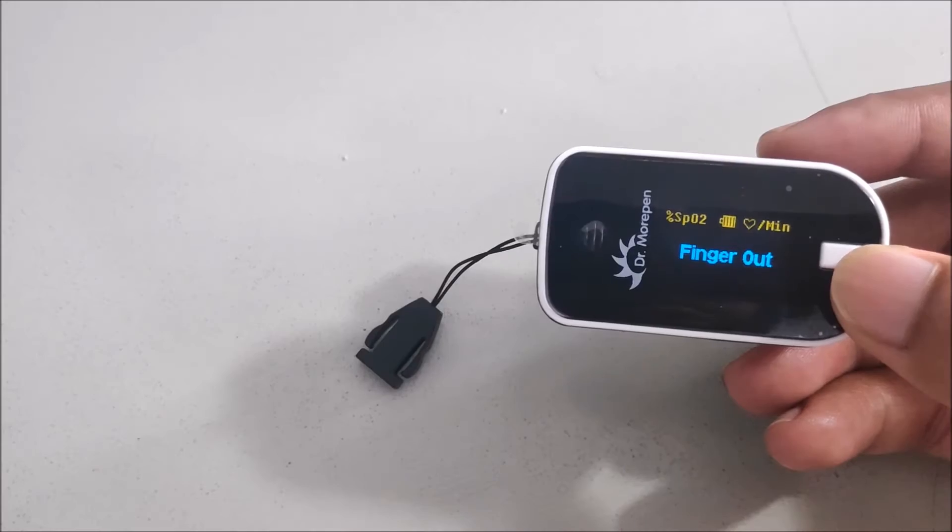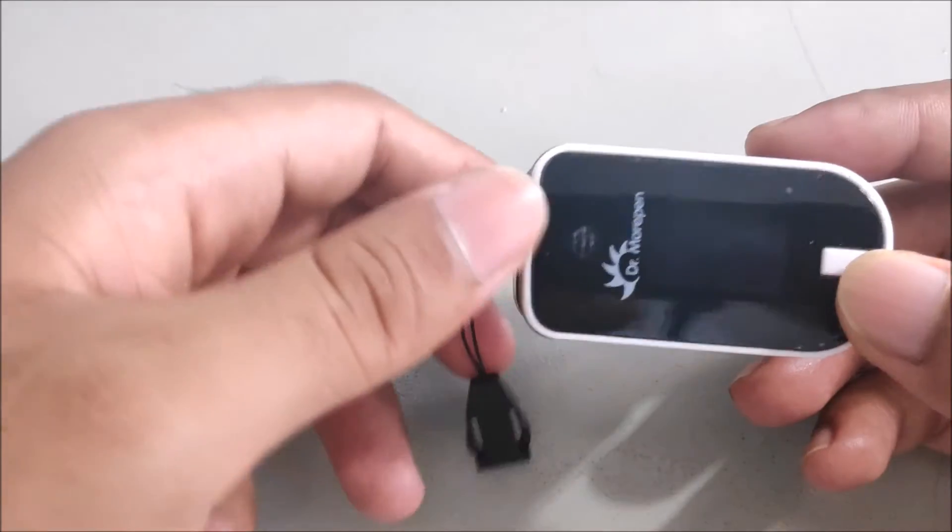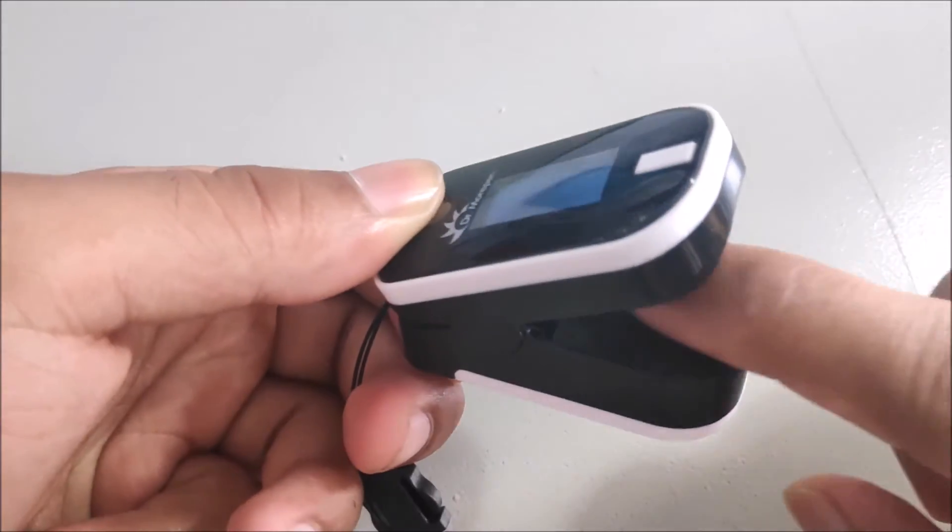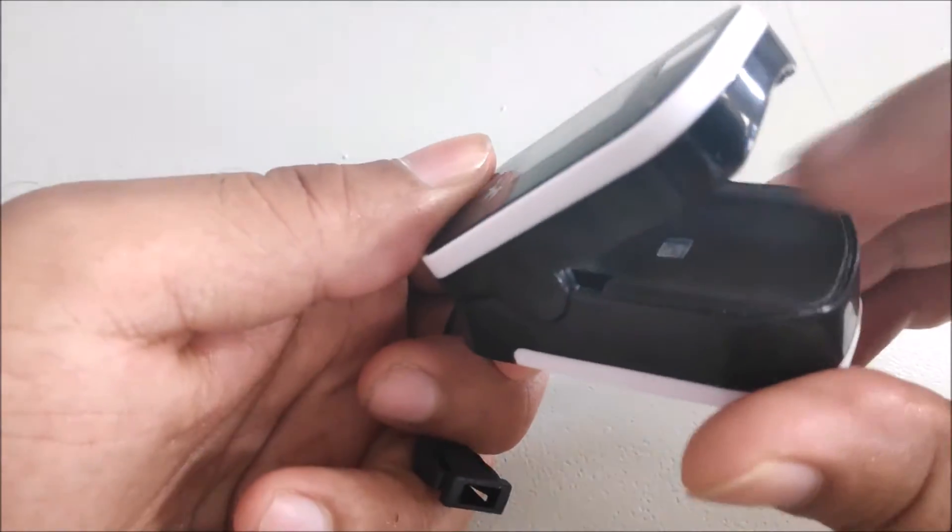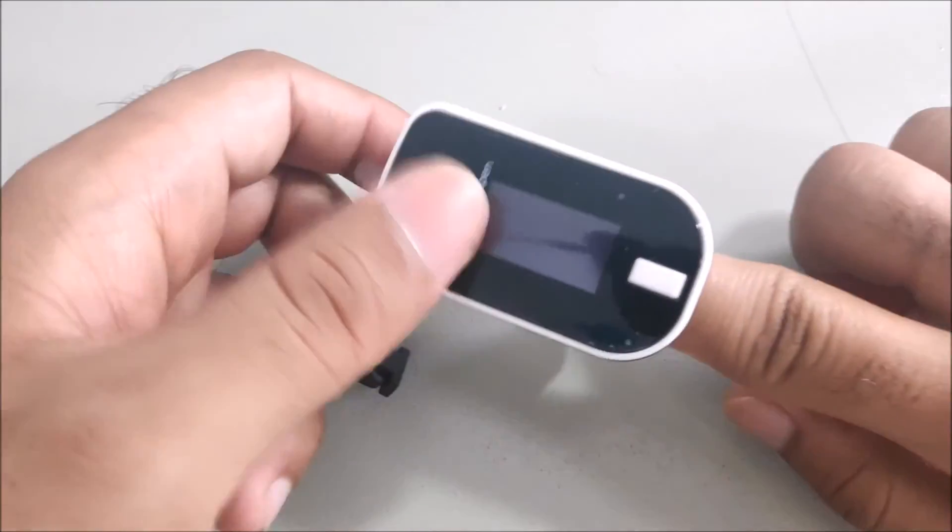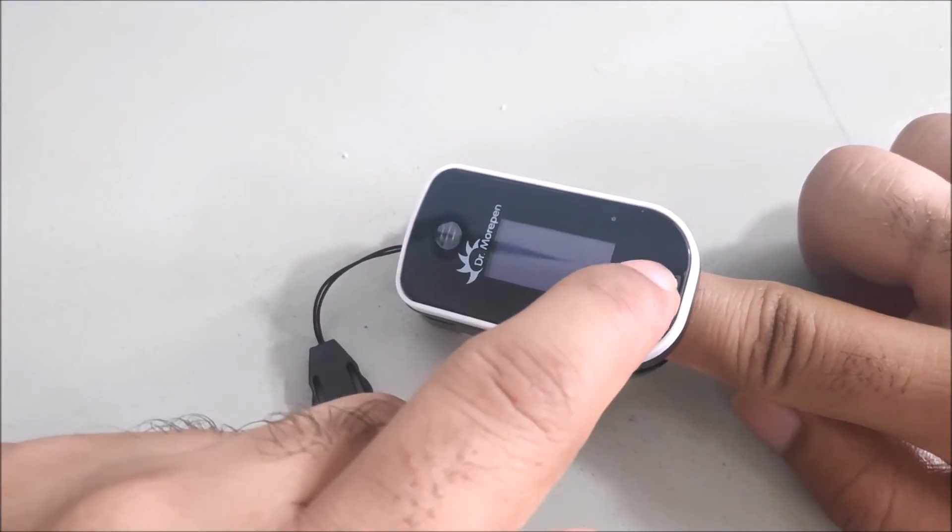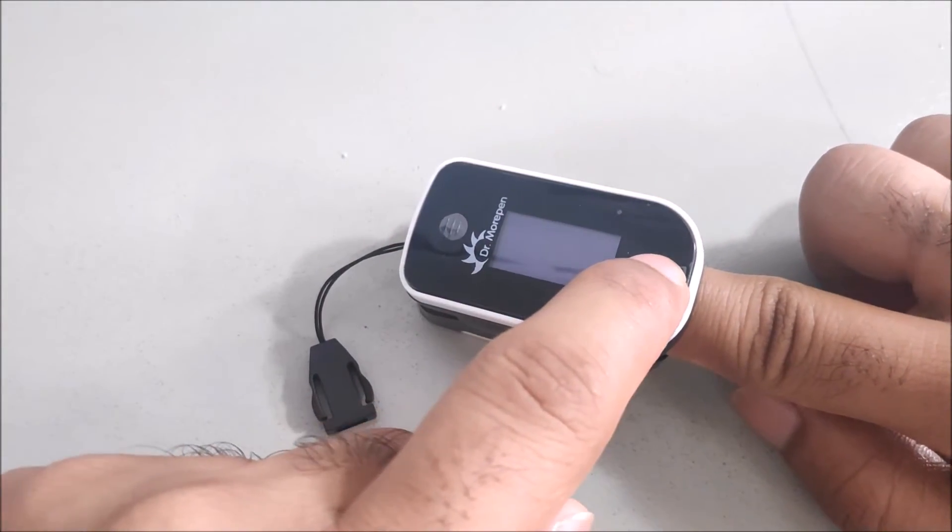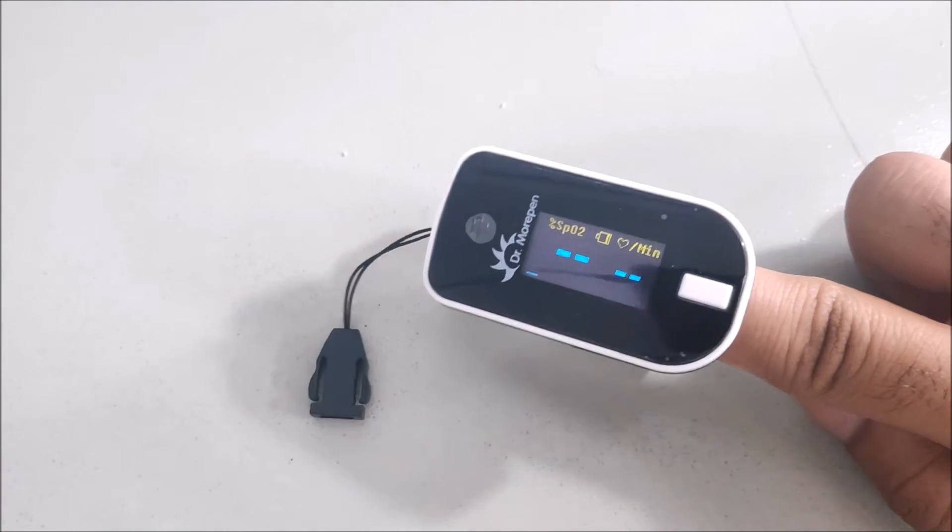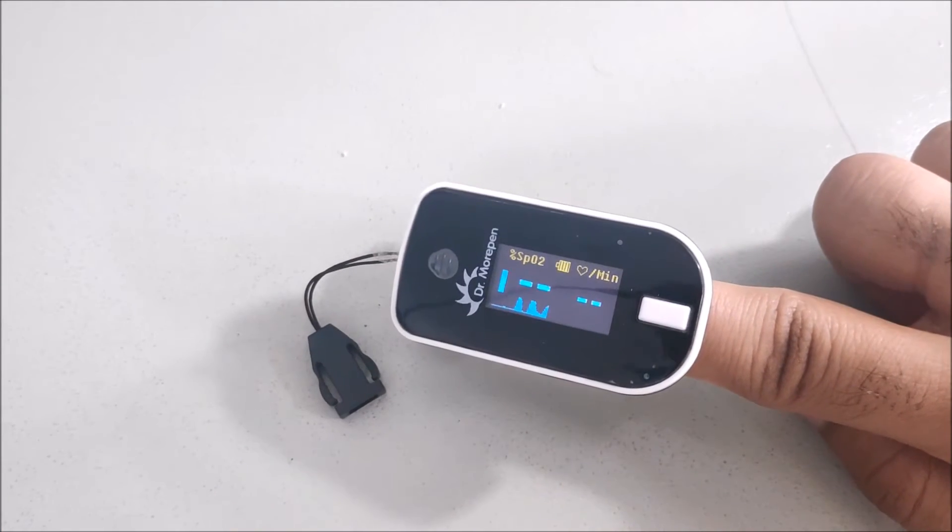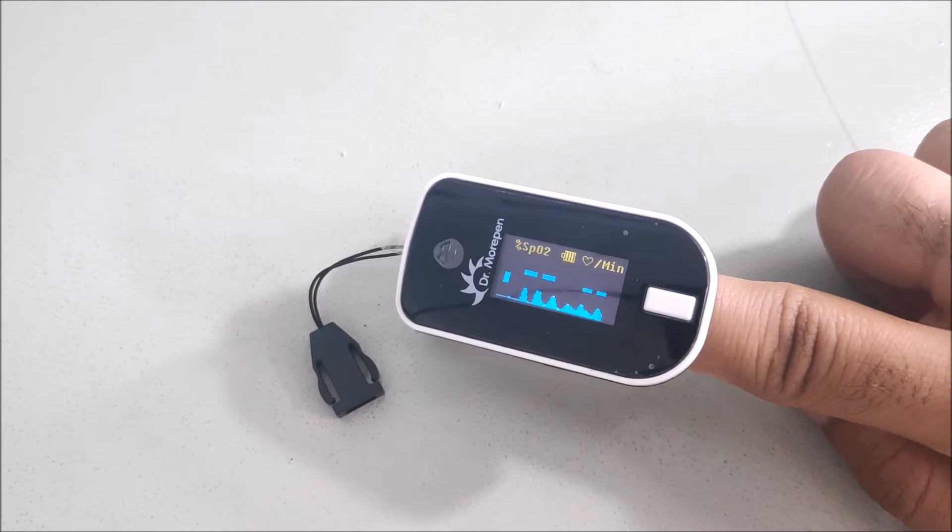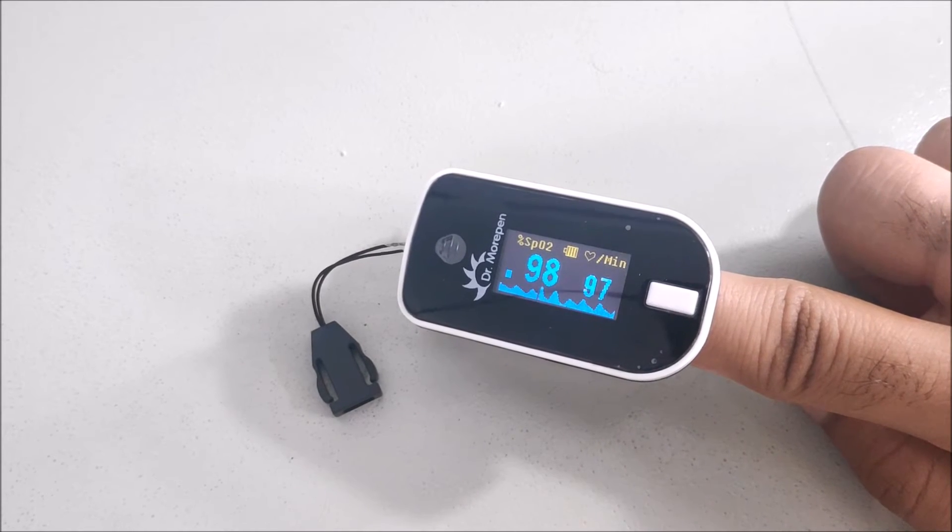Now I am going to insert my finger this way. And when I press the button, it will show me the readings. As you can see, there's a bar on the side and a graph at the bottom.